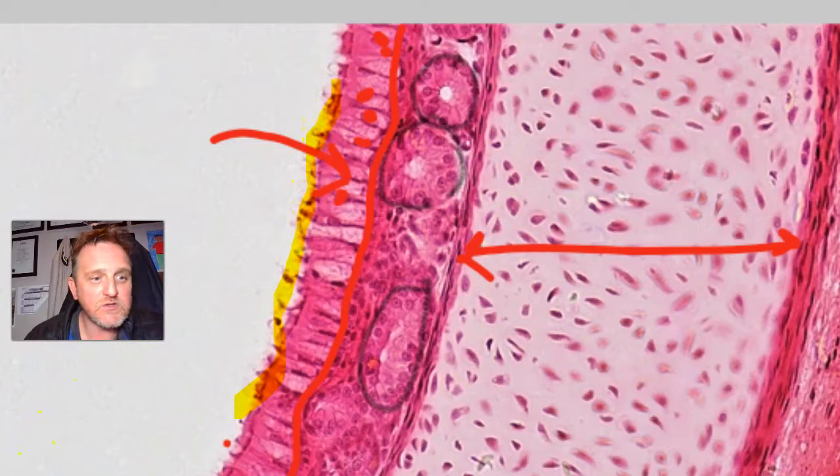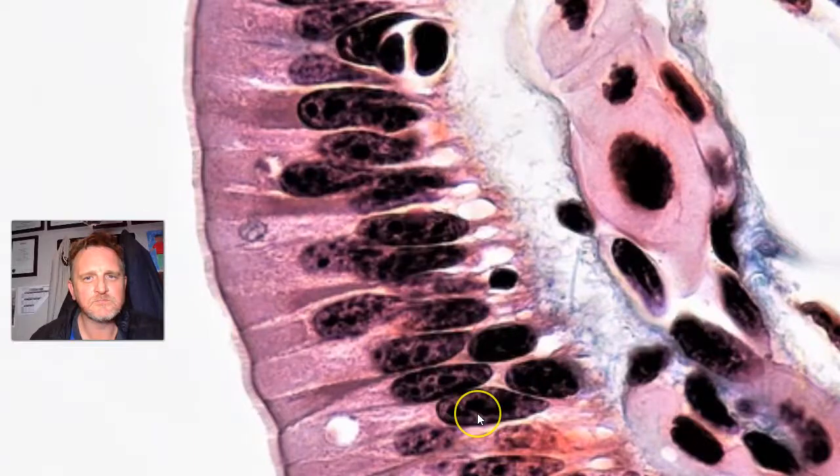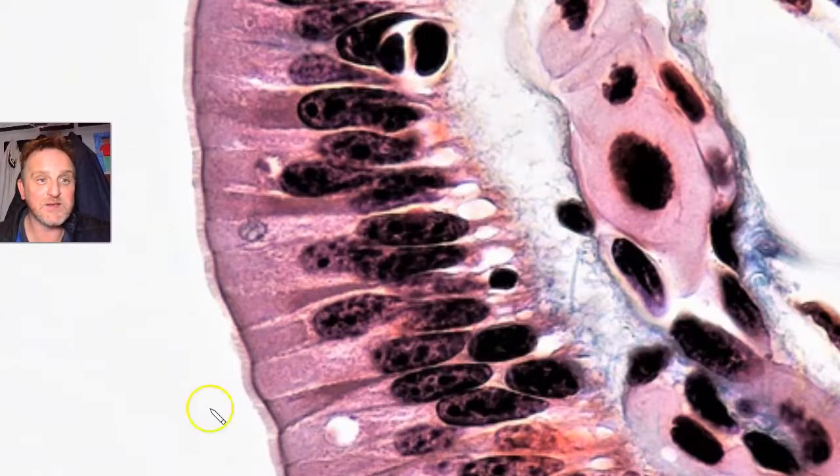The next image shows it in much more detail. Now, this is really a great image, isn't it? Because the nuclei are so beautifully highlighted. This is the definition of pseudostratification, isn't it? What do I mean? Well, if we look at the individual cells, we can trace, for instance, this one.